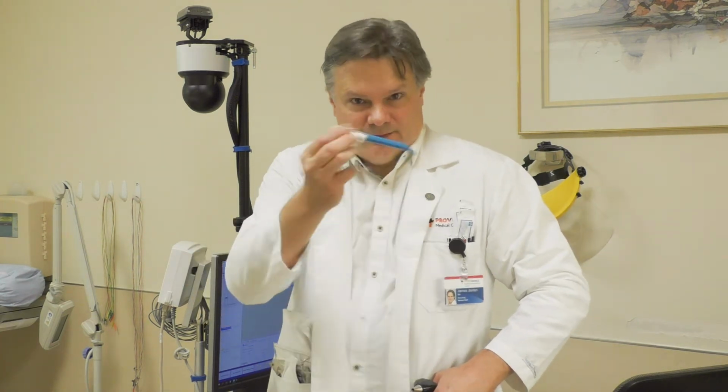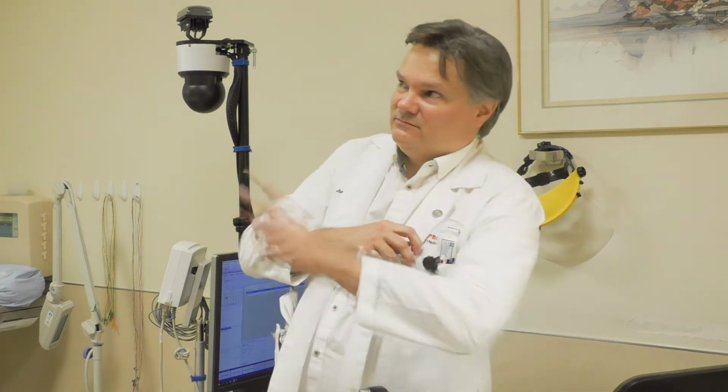Then you'll test naming, something just quick and basic. Can you tell me what this is called? You know, a pen, or point to a clock on the wall, something that's available and easy. And then you'll test command as well as motor. You want them to maybe lift up both of their arms. We'll be able to see maybe an asymmetry if there's a Todd's paralysis, or we'll be able to see that one arm is not able to do something because it's having a seizure.